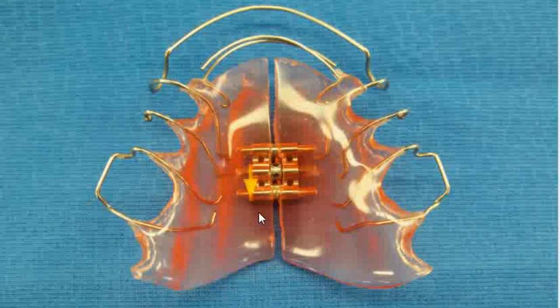For adult patients, you may want 2 screws to provide more force. 2 screws can also be helpful if you want to expand the anterior region more than the posterior region. You can have the patient stop turning the posterior screw and only activate the anterior one.